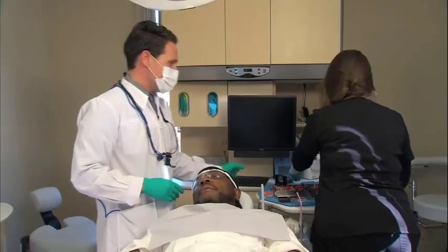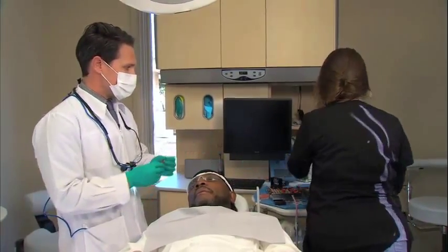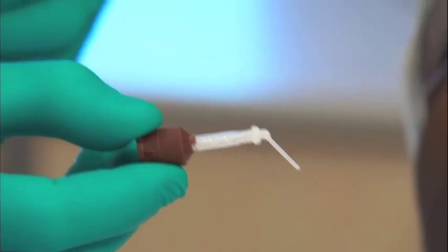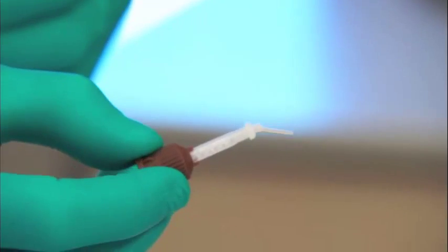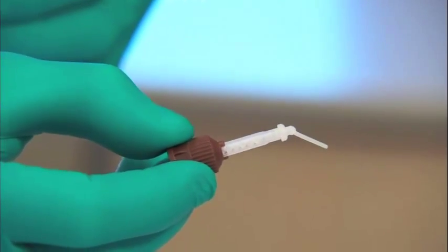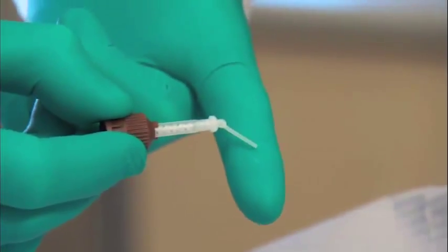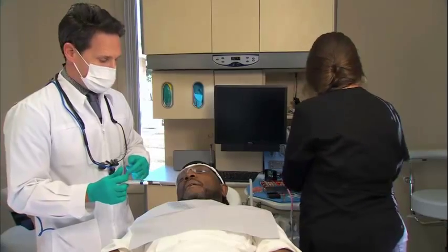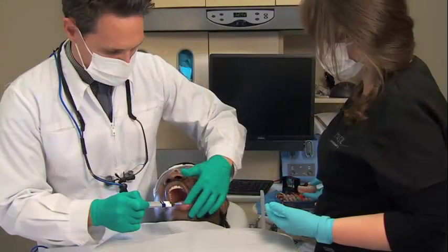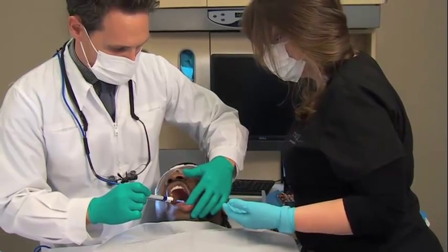The Fit Test CNB actually comes with an endo-style tip which has a thinner profile down at the delivery end. You can see how thin the material extrudes out of there, so we get a very accurate delivery. We're going to place this between the attachment and the implant, and you do have to work fairly rapidly because this material sets up very quickly.